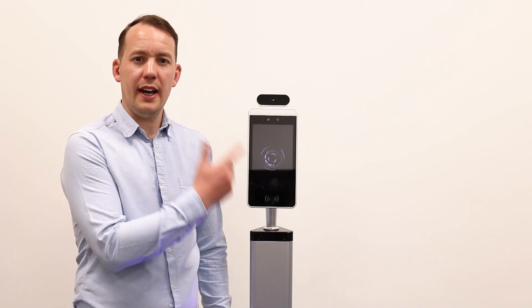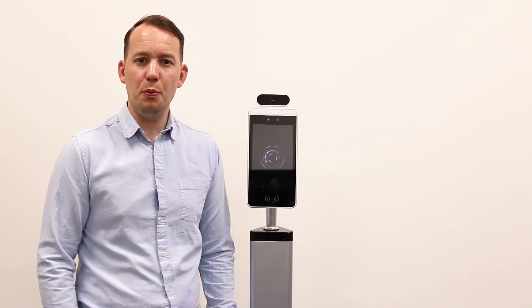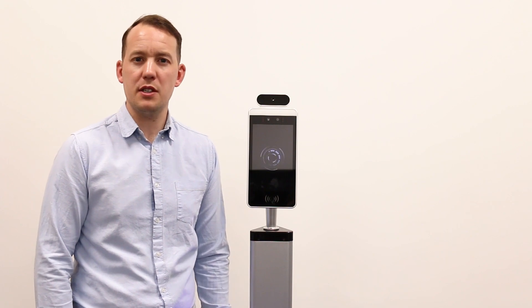In this video I'm going to show you how you can get a temperature screening kiosk up and running in a few simple steps.